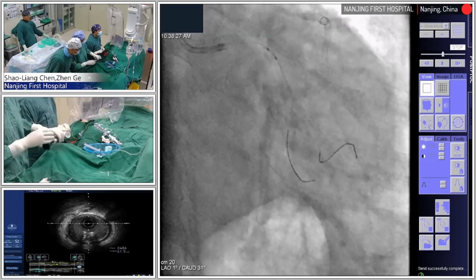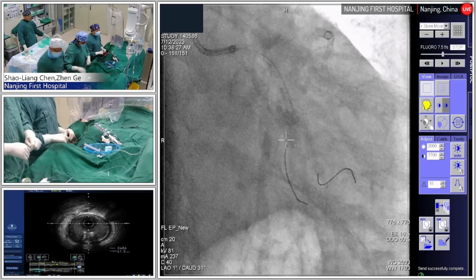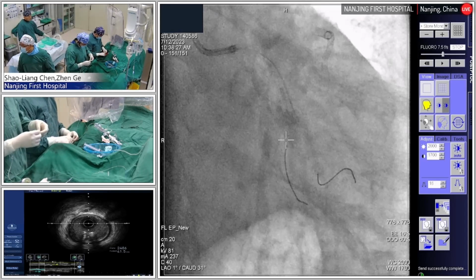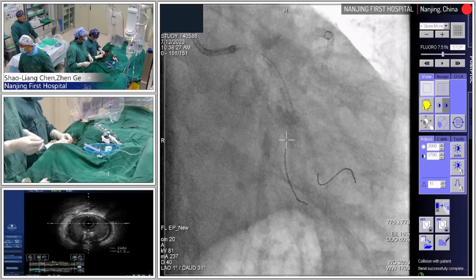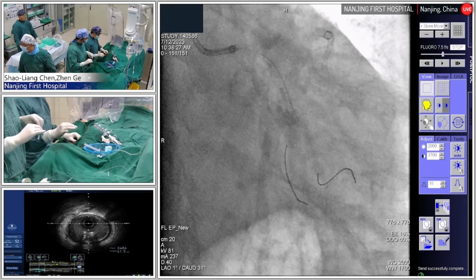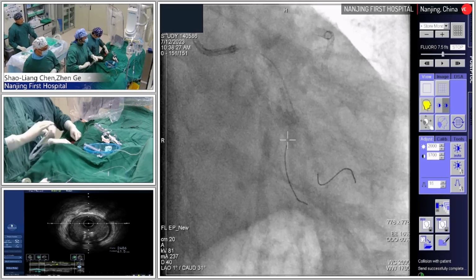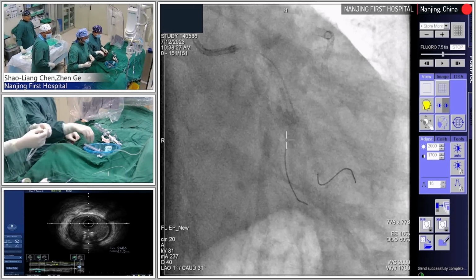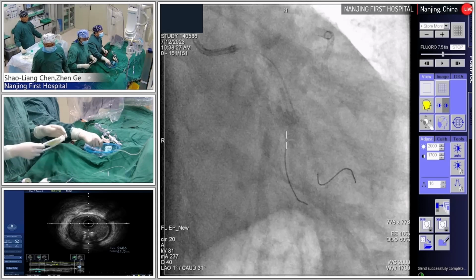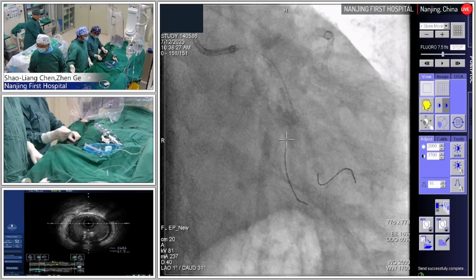305, 3.5, the new one. This is the 4. Yeah, it's not for 305, but because they used... so it cannot cross. I think use a new one, because the side branch wire is still in position. Yes, I know. Did you try to remove the side branch wire?